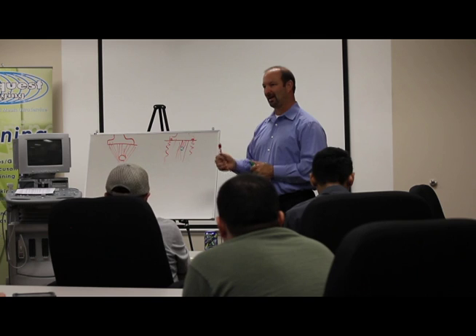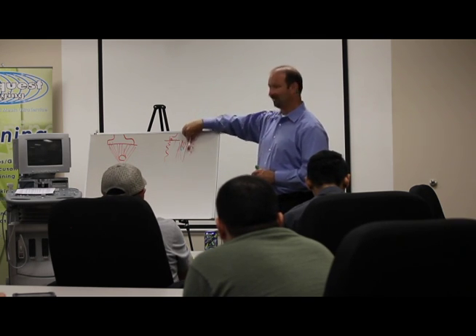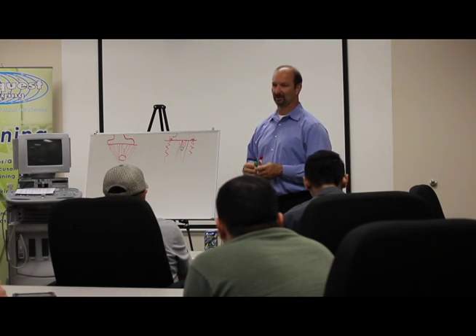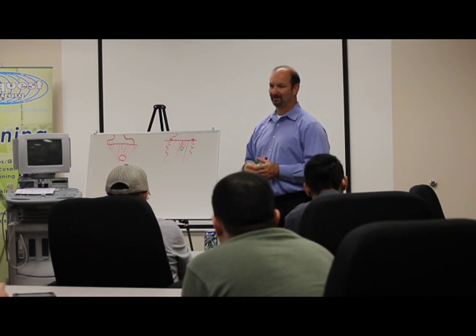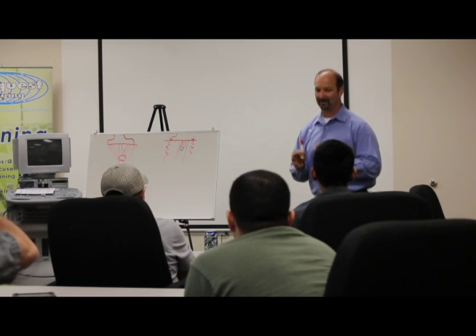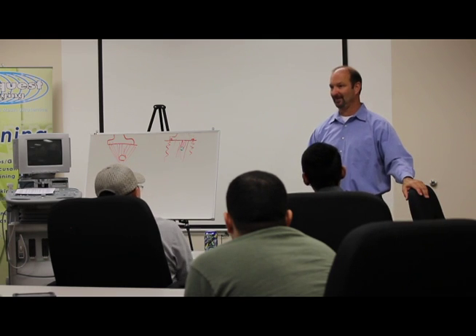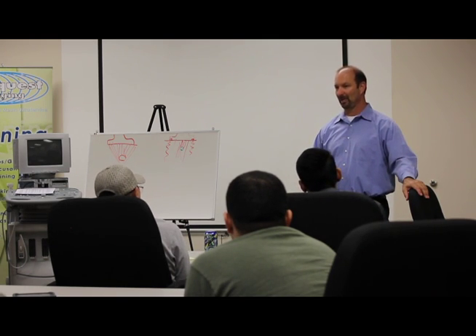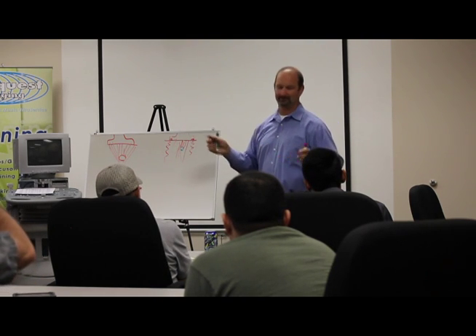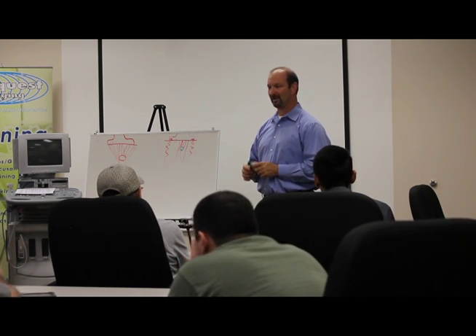If you knew what you were looking at, that's one thing. If you're surveying, you don't know what you're going to find, then these outside borders, you could come across the information that you're trying to look for. So, Conquest is one of the most specific, really nitpicky on transducers, and that's great. I mean, you can get away with one element being bad in here because it'll be covered up 10 times over by all the surrounding elements. You're not going to lose something like that.